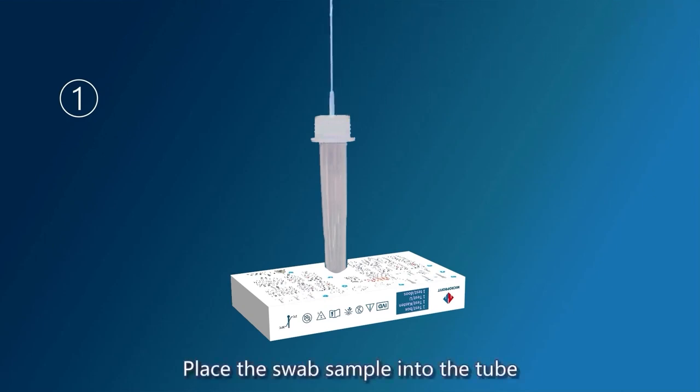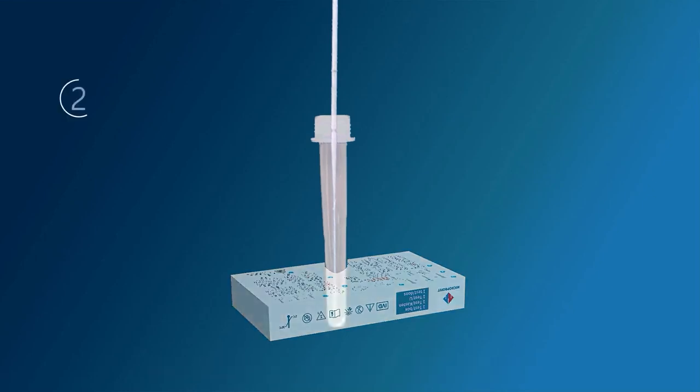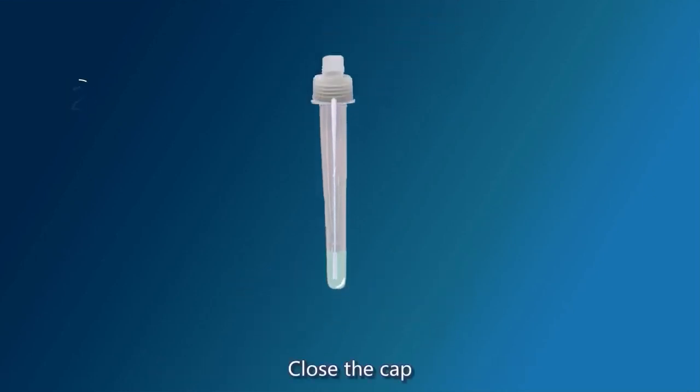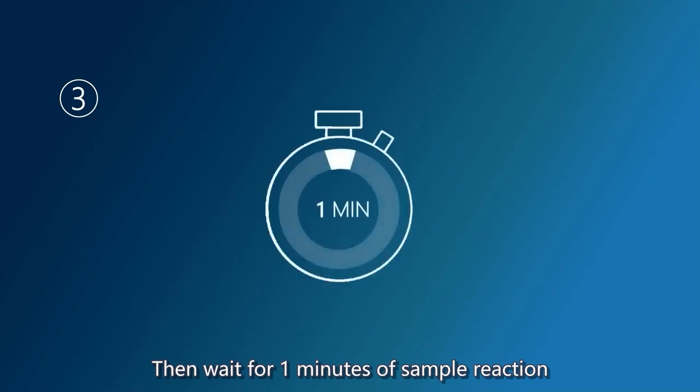Place the swab sample into the tube, then break the swab at the swab node and leave the lower half in the treatment tube. Close the cap, squeeze the swab 10 times in the test tube, then wait for one minute of sample reaction.